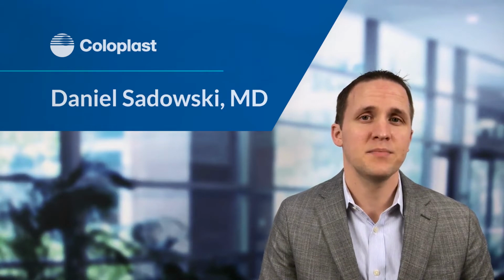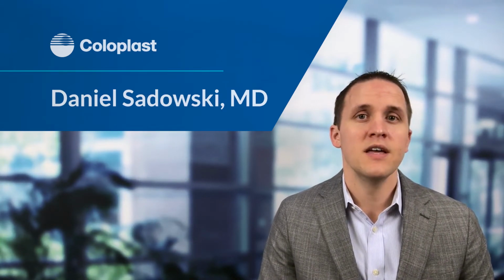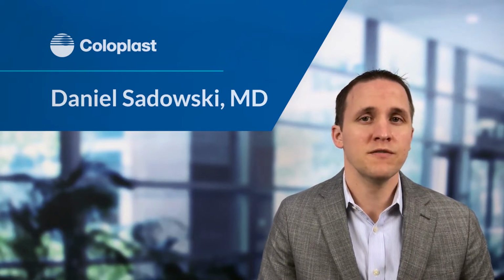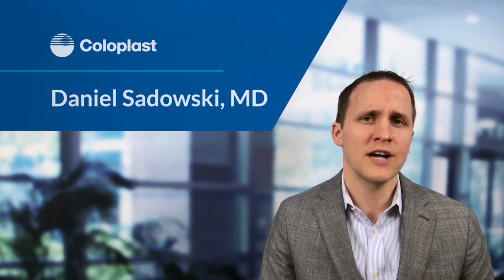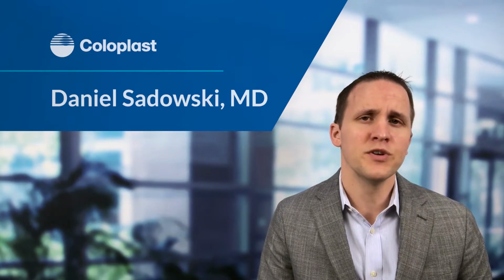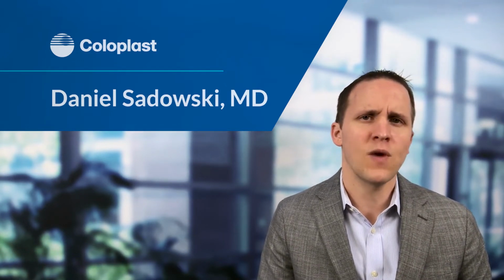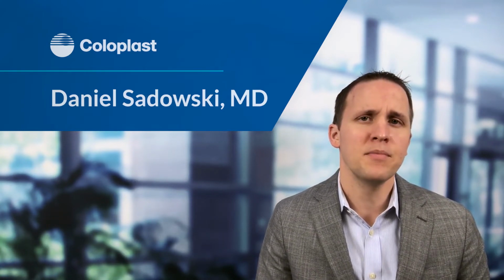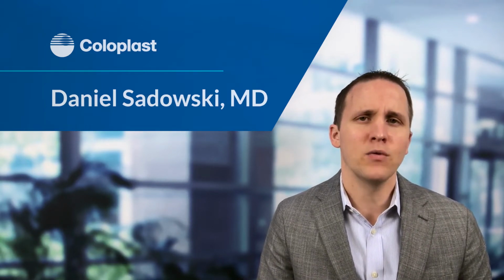The two main types of implants available are the malleable and the inflatable penile prosthesis. Most of the time we would use the inflatable penile prosthesis as it provides a more natural feeling erection in that you can pump it up to have the erection and then deflate it to return the penis to a soft state. The malleable or semi-rigid rods are ones that are always firm, and then you can bend it up if you want to utilize it for sexual activity, and then bend it down when you're done.